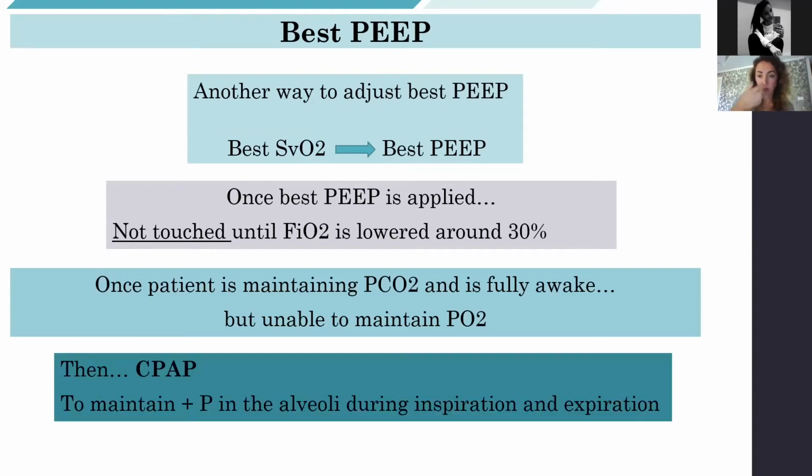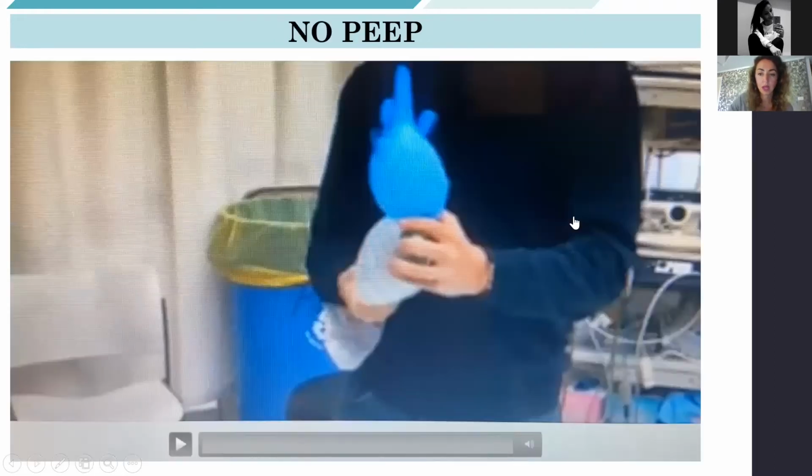Since there is no tidal volume or respiration from the machine in the CPAP mode, the patient must breathe on his own, because every ventilation will be from the patient by himself and we cannot help him with the machine. If the patient stops breathing, we will have to place him back on the other ventilator settings that we were discussing before.